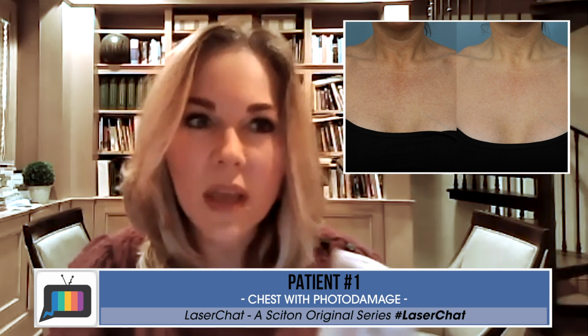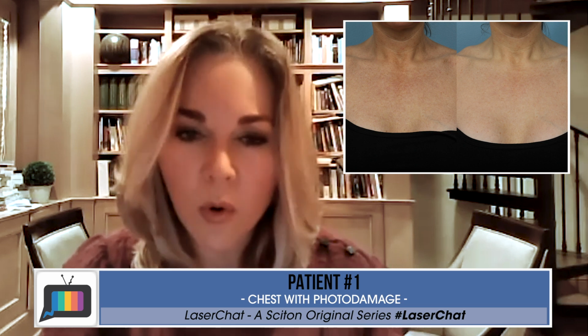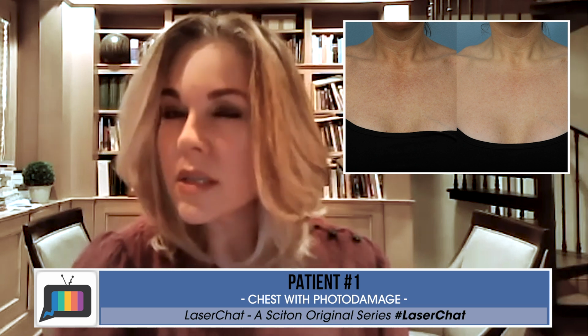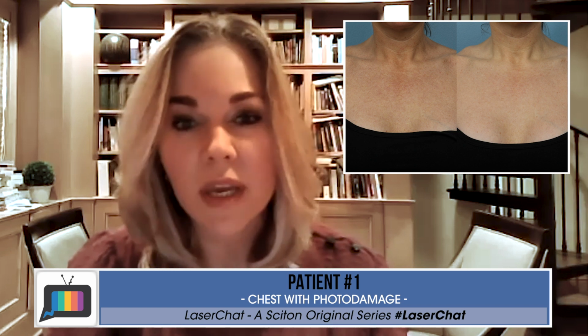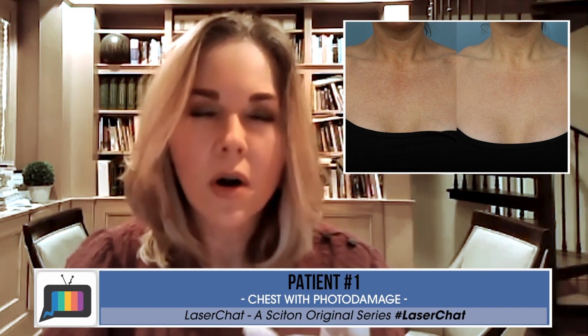And as I'm using the HERO more and more, I find that I'm being a little bit more aggressive with it, particularly on skin types 2 and 3, because the energies are lower, so you can put in a lot more overall energy and still get a nice complexion improvement. It's really quite nice. Absolutely, I could not agree with you more.